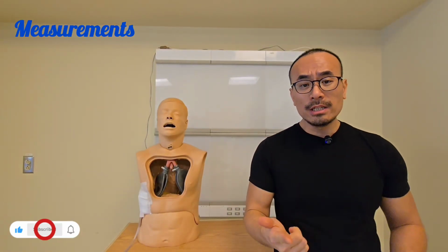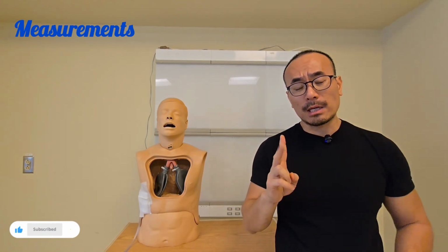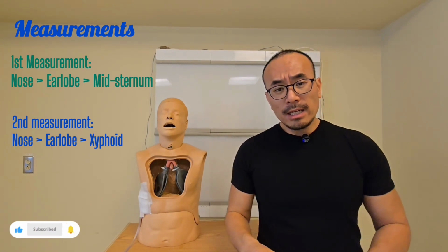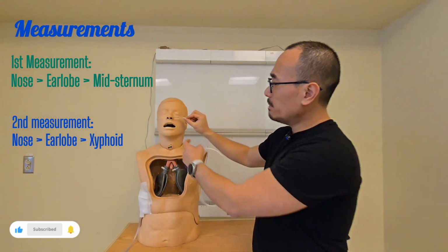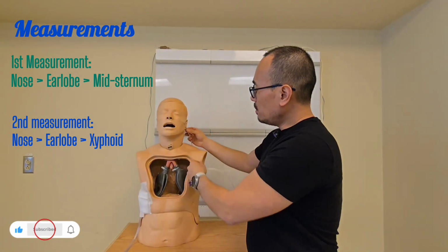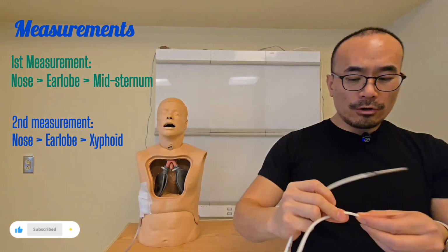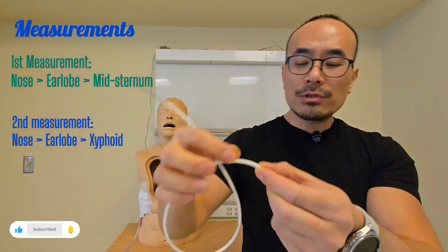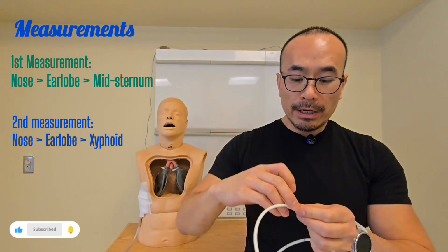Next, we're going to measure the length of the NG. And there are two steps that we can actually do this. There's a one step and there's a two step. The one step is the traditional step that you learn in nursing school. And we are going to start by the tip of the NG. It's going to go to the tip of the nose, to the earlobe, and down to the xiphoid process. And right here for our gentleman, it's about 55 centimeters, okay? So when we put that on, we're gonna grab a little piece of tape so that we can mark it.